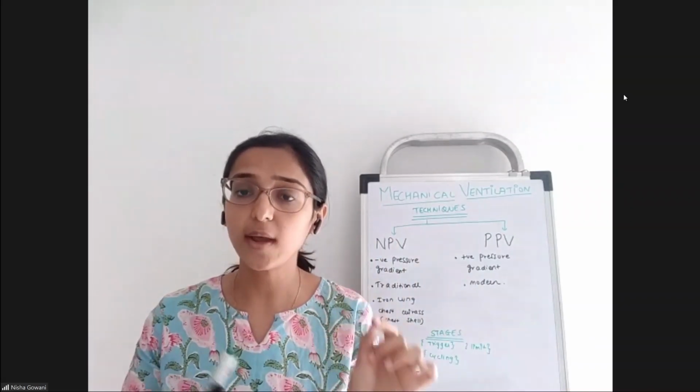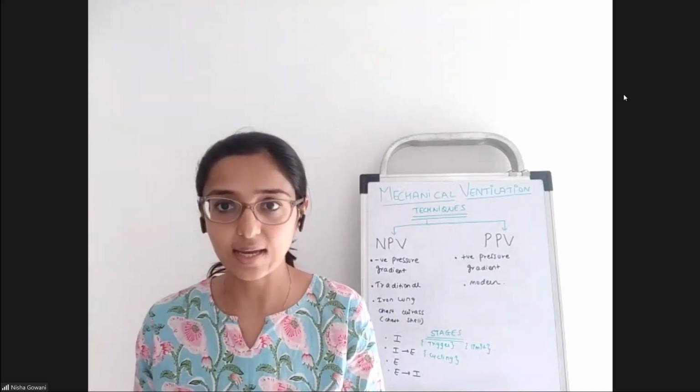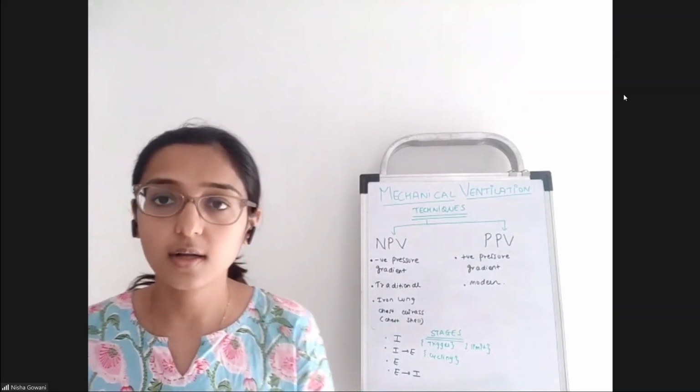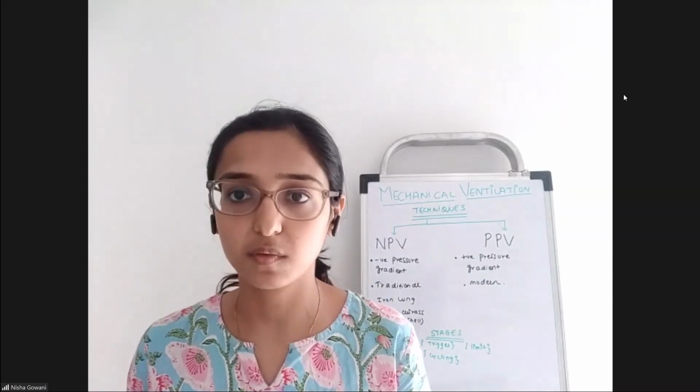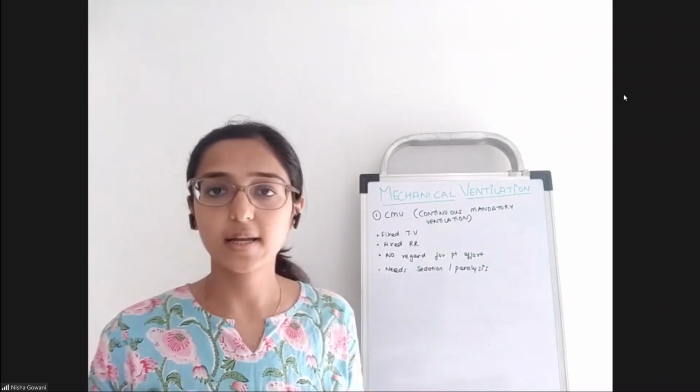So cycling means when will one phase move over to the next phase. That is called cycling. All right. Now we shall go through the different modes of mechanical ventilation. The first mode that we shall understand is the continuous mandatory ventilation.